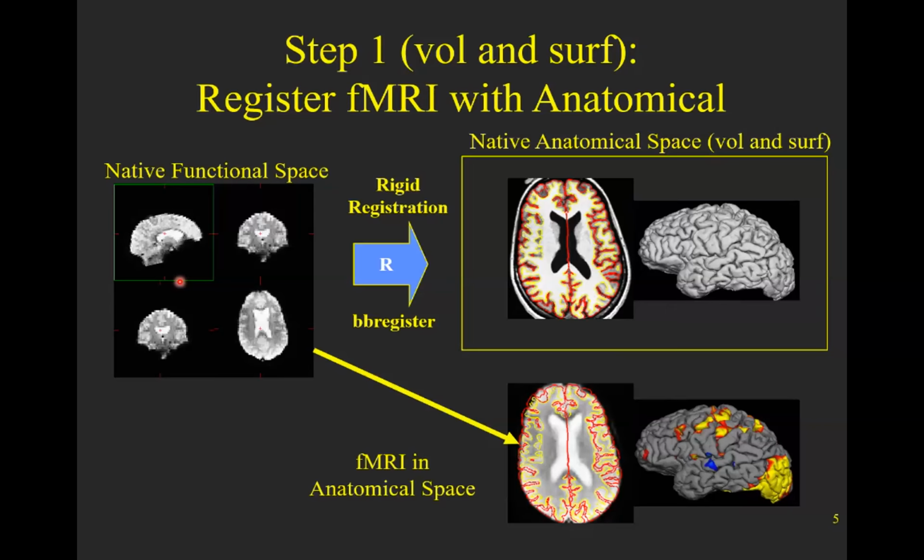And so the basic idea is that you can move your head in 6 different ways. You can move your head left to right, you can move your head forward and backwards, move your head up and down. You can shake your head yes, you can shake your head no.